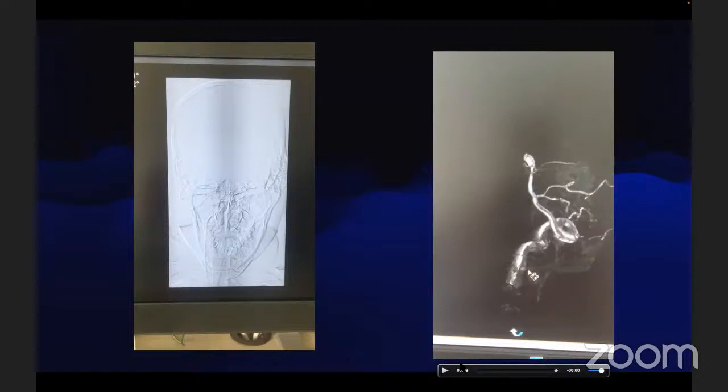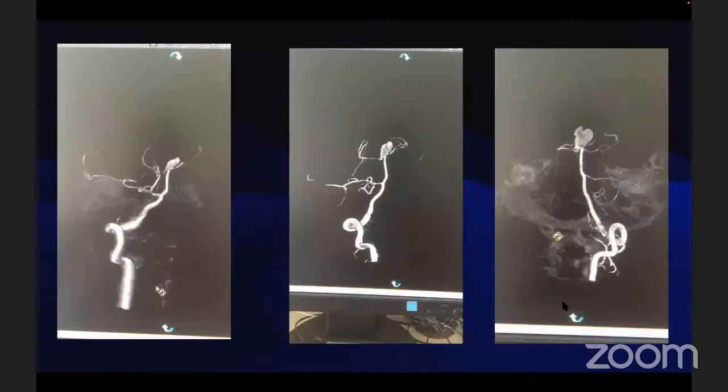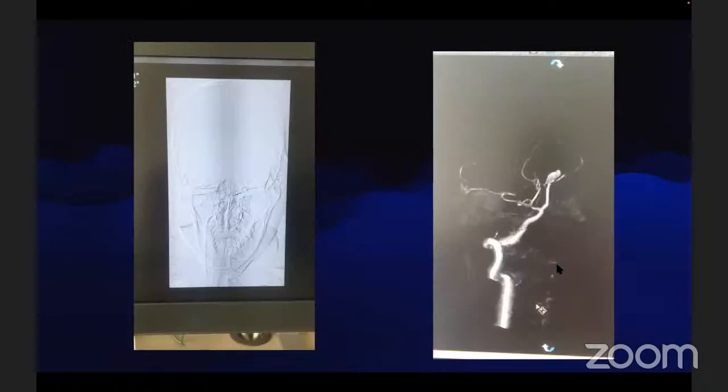If you use antiplatelets and place coils, or if you use some stent or place some coil, it is going to refill again. So in this case I prefer placing some coils. I know the size of the aneurysm from the MRI. What is the size of the aneurysm, sir? Fill up the rest of the part slowly, and repeat the angiogram as early as possible, and then decide the further treatment.